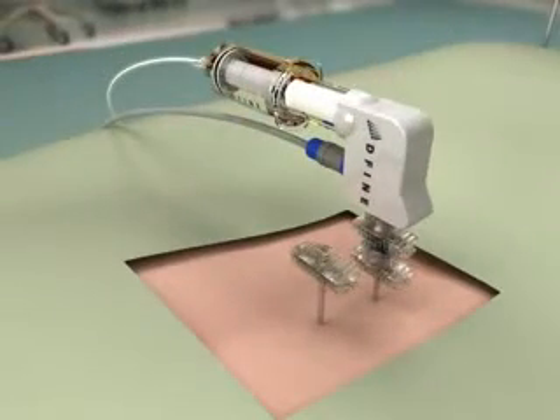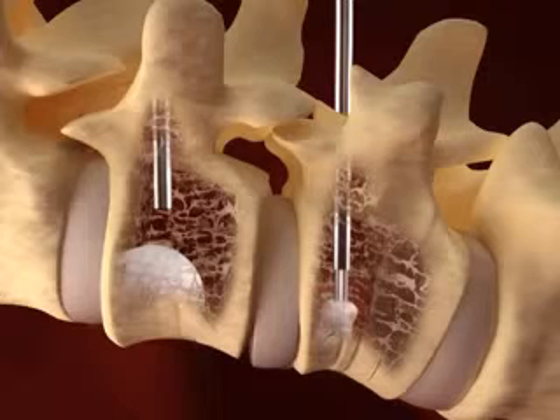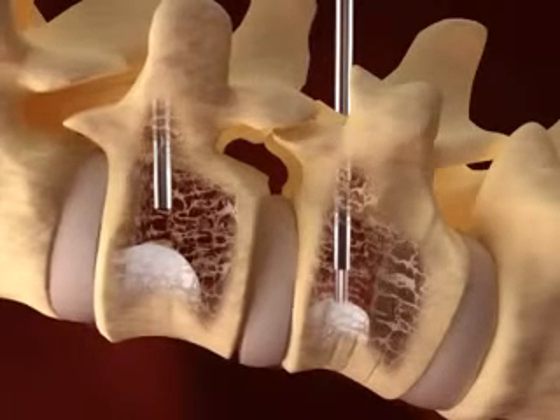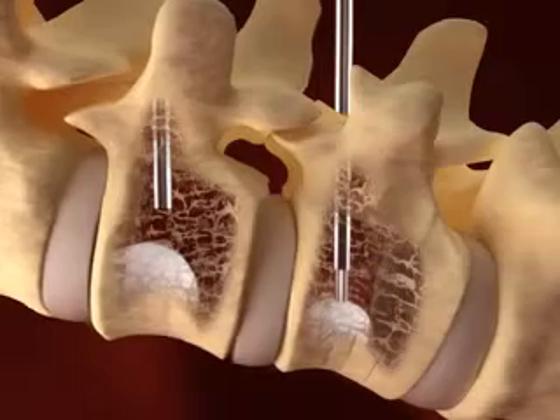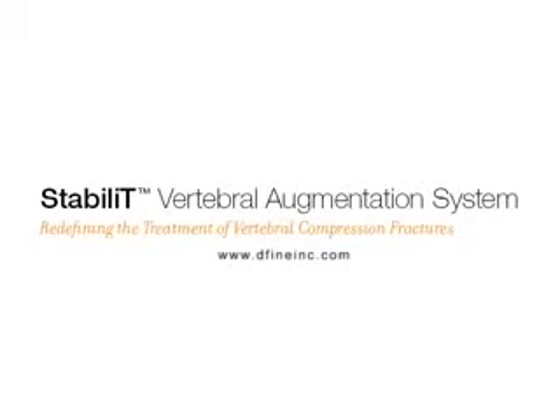The physician may then place the delivery cannula into a second working cannula and deliver cement. This delivery process provides for streamlined access into the vertebral body and will optimize cement delivery speed. Contact a DFINE representative today to learn more about how the Stability Vertebral Augmentation System is redefining the treatment of vertebral compression fractures.